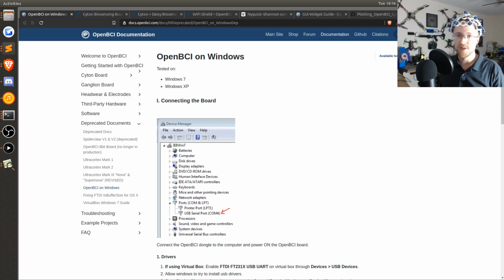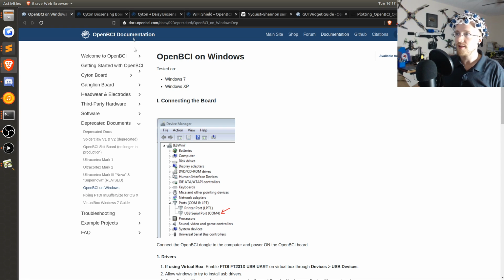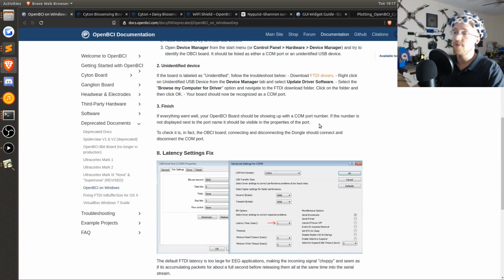The first major issue was the bursting that I was experiencing, and possibly bursting is still the wrong word, but nobody corrected me on that, so I'm going to keep calling it bursting. My solution was first I tested on my MacBook with the Python OpenBCI, and I didn't have that issue, and then I tested on Ubuntu on my main machine because I dual boot Linux, and I didn't have the problem. So my solution was actually just to change operating system. Now that might be a little unruly for everybody. So William Croft linked to this document here, which apparently is under deprecated documents, but I'm assured it still works. I haven't tested it, but they say it works. So if you're on Windows and you need to fix that issue, check that out.